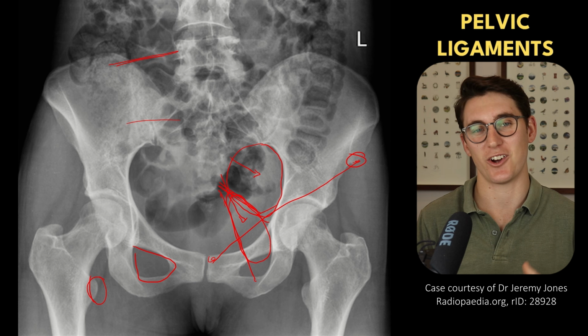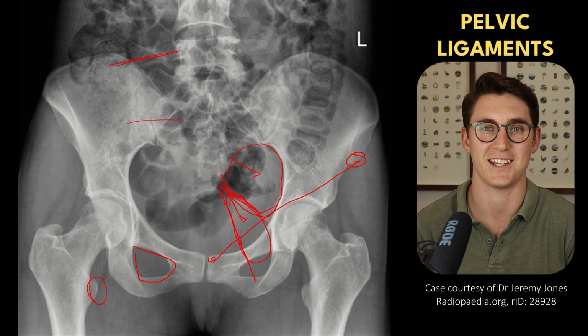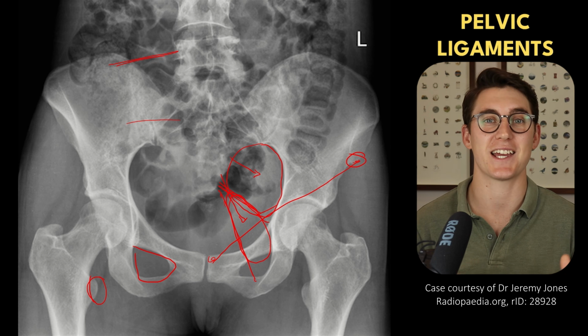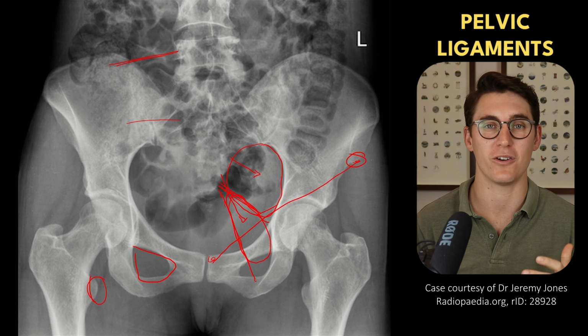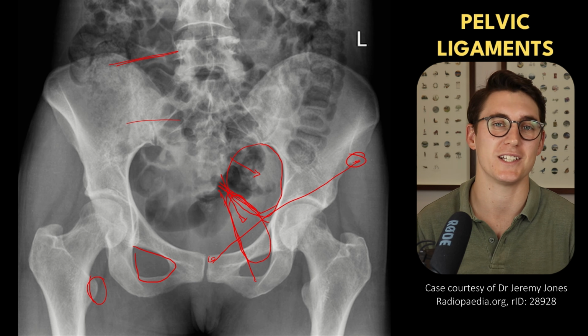So it's been a lot. I'll go through the lecture multiple times if you need to become more and more familiar with the anatomy. This is going to need to be second nature before we then head into a pelvic or hip MRI and try and identify even smaller, more detailed anatomy.